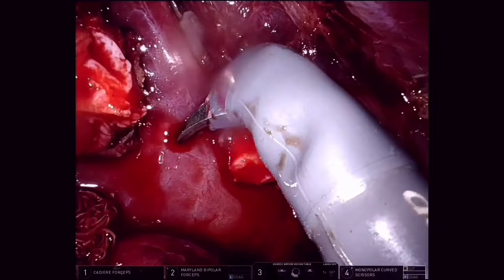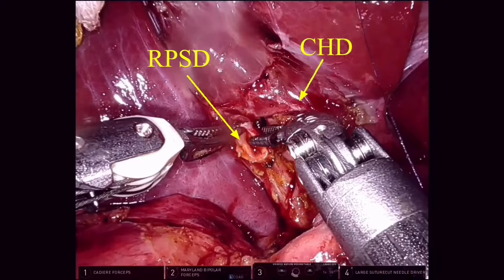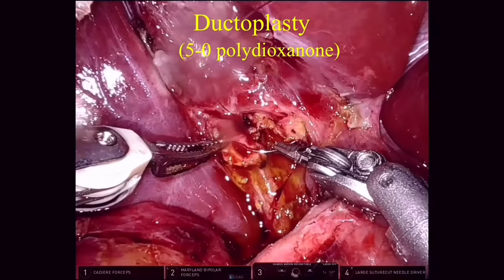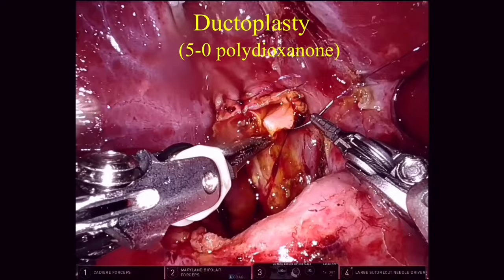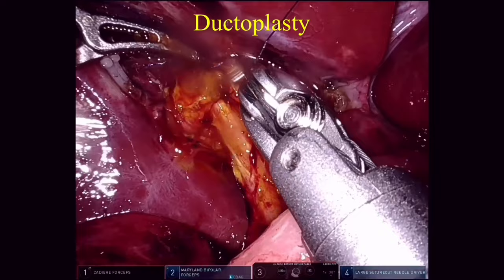We use energy sparingly so as not to make the ductal margin ischemic. This is the common hepatic duct with right anterior sectoral duct and the left hepatic duct, and this is the right posterior sectoral duct. The ductoplasty is started using 5-0 polydioxanone suture. This is an interrupted anastomosis between the aberrant right posterior sectoral duct and the common hepatic duct.